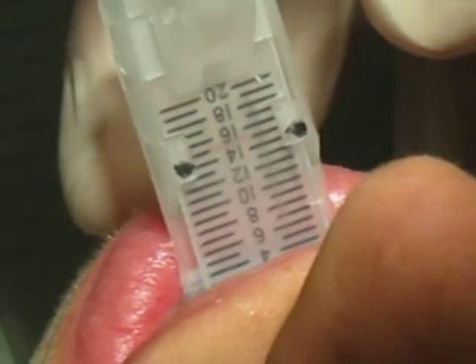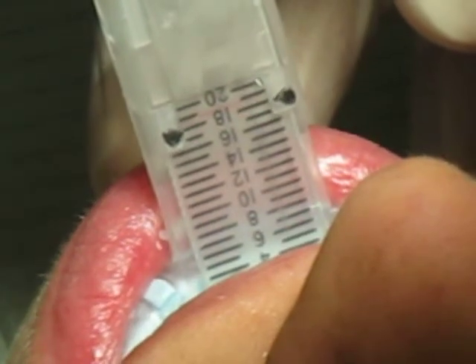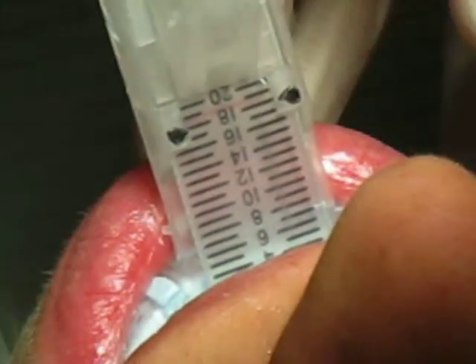The second scale reading is the patient's full protrusive position. Ask the patient to slowly move their jaw forward as far as possible. In this case, the patient's full protrusive position is 19.